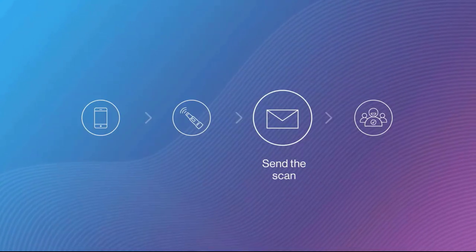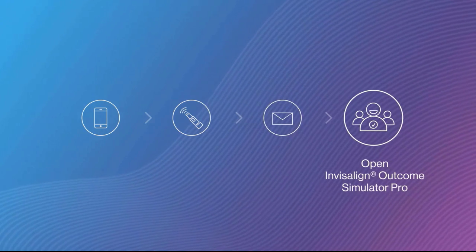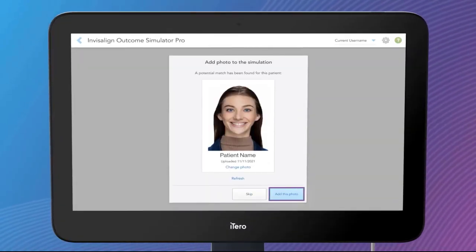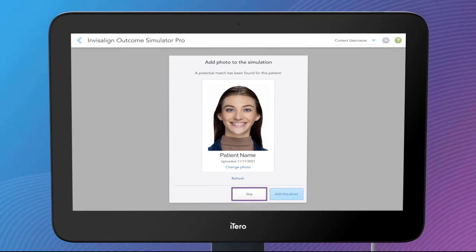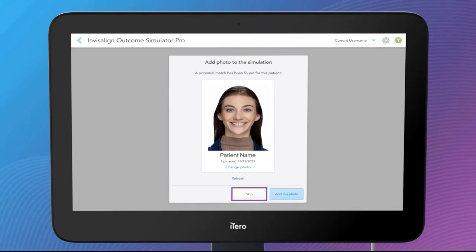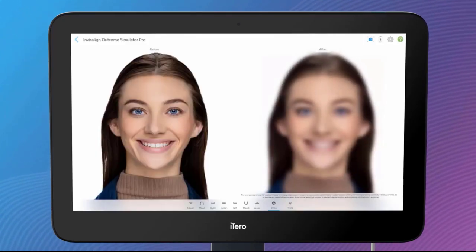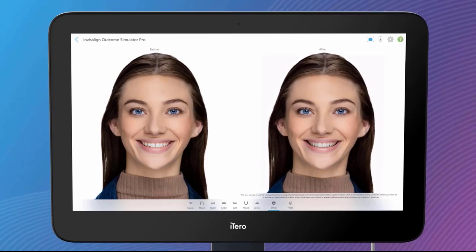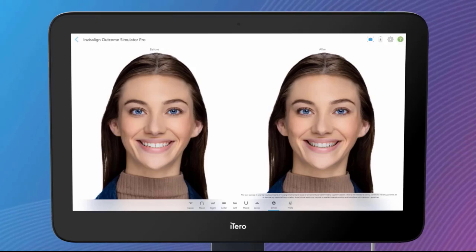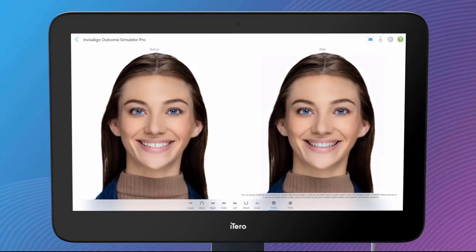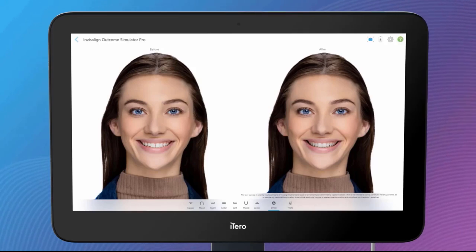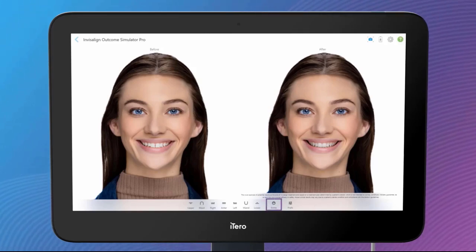The fourth and final step is to open the simulation. Confirm that the photo matches the patient by tapping the Add This Photo button. By selecting the Skip button, you can exclude photos from the simulation at this time and use only 3D Model View. Here is your patient's potential new smile. This view shows the current smile before treatment and the simulated smile after Invisalign treatment. Tap on the Smile button to toggle between the smile and the 3D Model View.